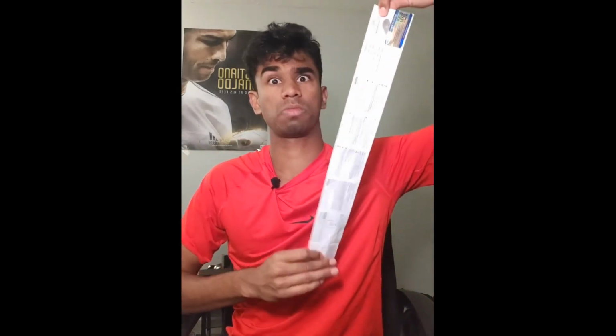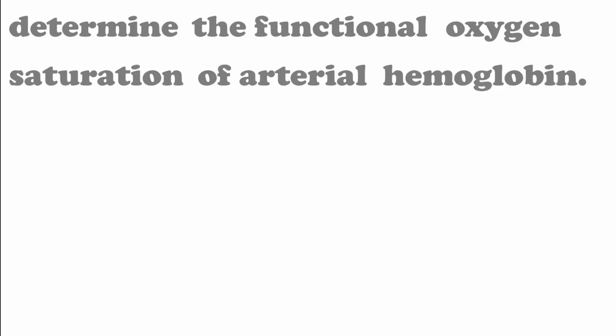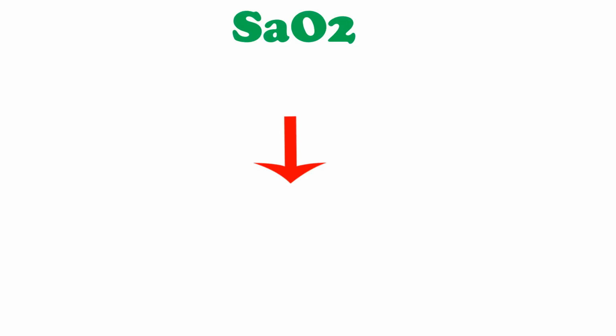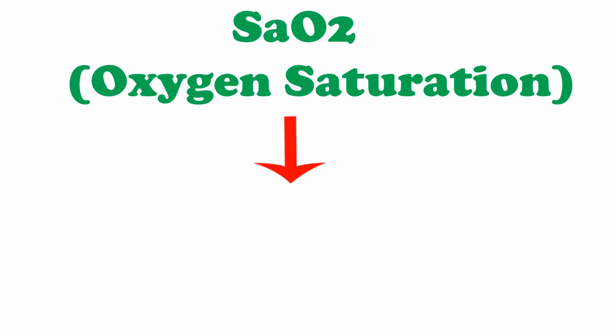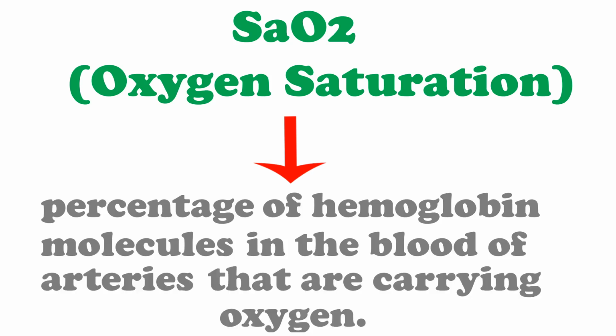Now, when I open the manual on this thing, yeah, I'm one of those guys who reads the manuals. It says that the main purpose of this thingamajig is to determine the functional oxygen saturation of arterial hemoglobin. Bruh, what does that even mean in English, bro? The functional oxygen saturation of arterial hemoglobin, known in short as SaO2, or oxygen saturation, is the percentage of hemoglobin molecules in the blood of arteries that are carrying oxygen.